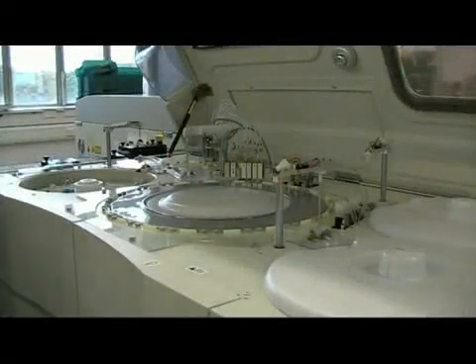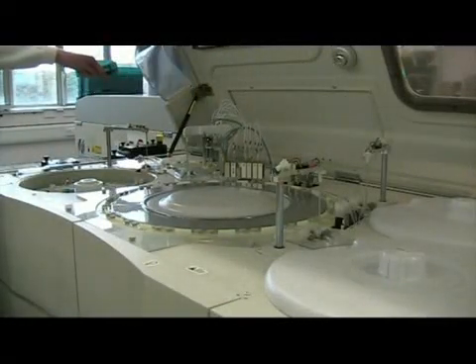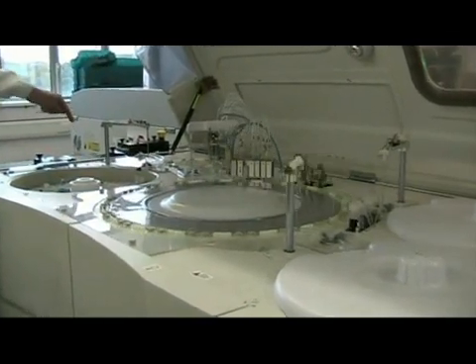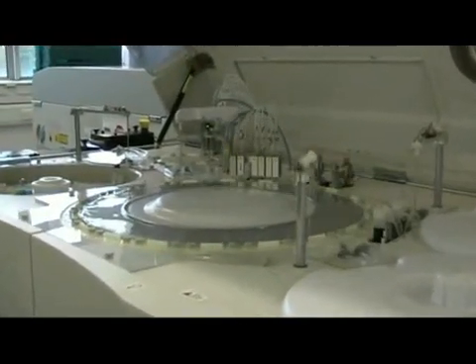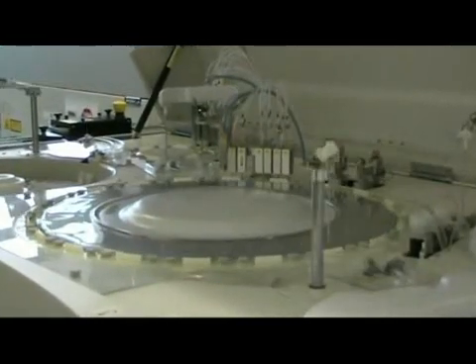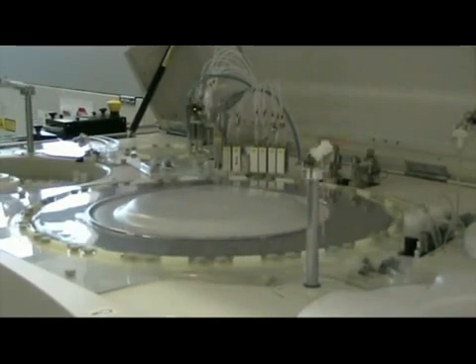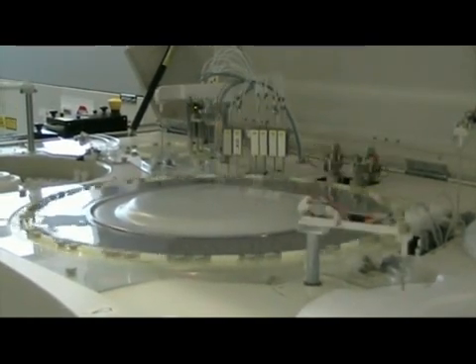What we've got here is a sample probe on this side which is taking sample directly from the track and putting it into the ion-selective electrode, which measures sodium, potassium, and chloride on this part of the machine.